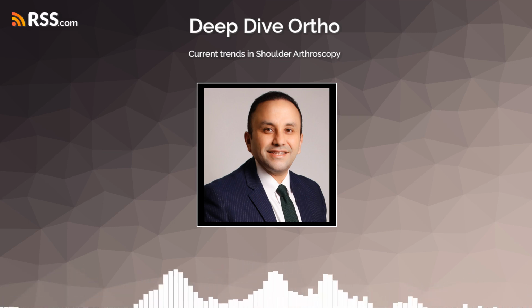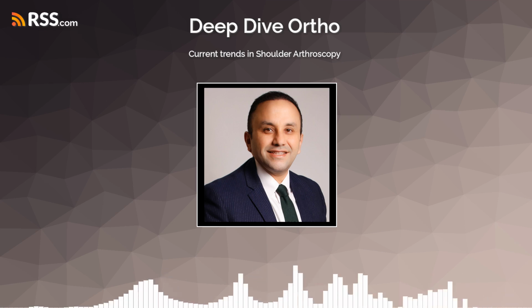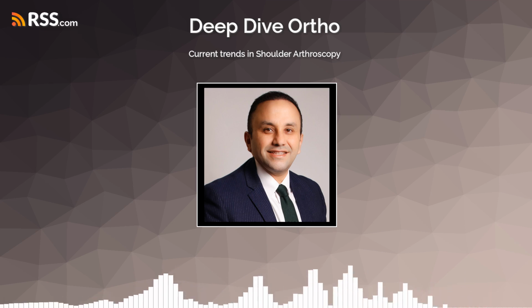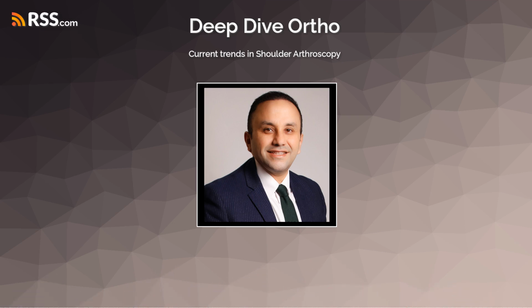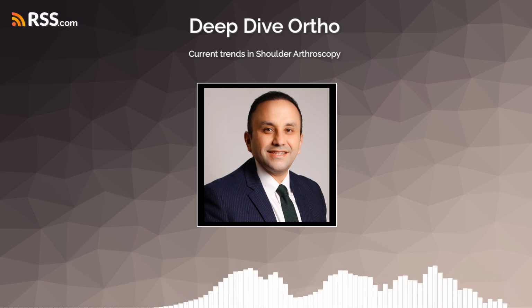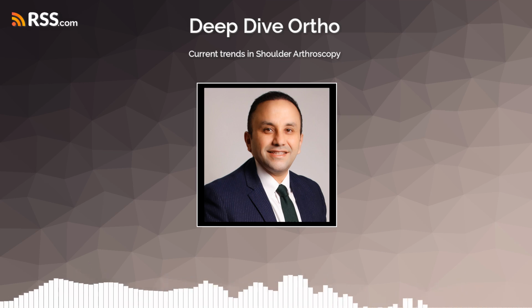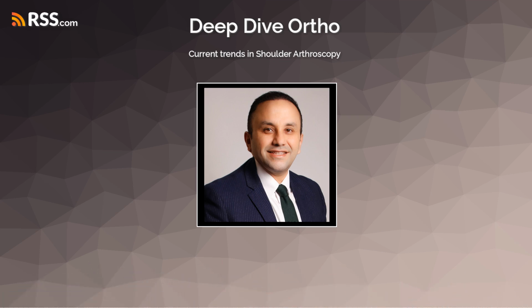In certain cases, where the goal is mainly to stabilize the shoulder joint to allow for better use of the hand, especially for tasks at waist level, a procedure called glenohumeral arthrodesis might be considered. Arthrodesis, fusing the joint. Exactly, surgically fusing the humeral head to the glenoid socket. Arthroscopic-assisted techniques can be used here to help prepare the joint surfaces for fusion, removing any remaining cartilage, and also to help guide the placement of the wires or screws that hold the bones together rigidly while they heal into one solid piece.